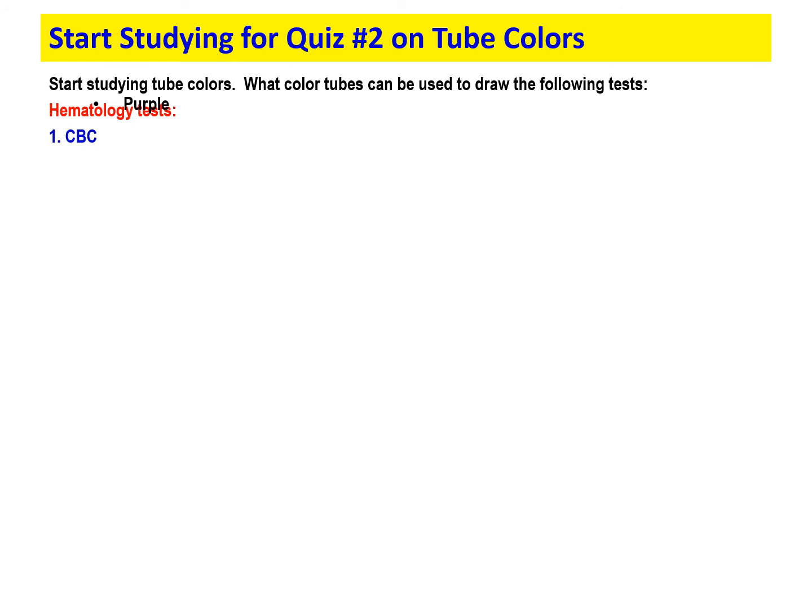So please make sure that you use these slides by pausing them at each question and see if you guys are getting the correct answer. It's a great way to study. So let's get started.